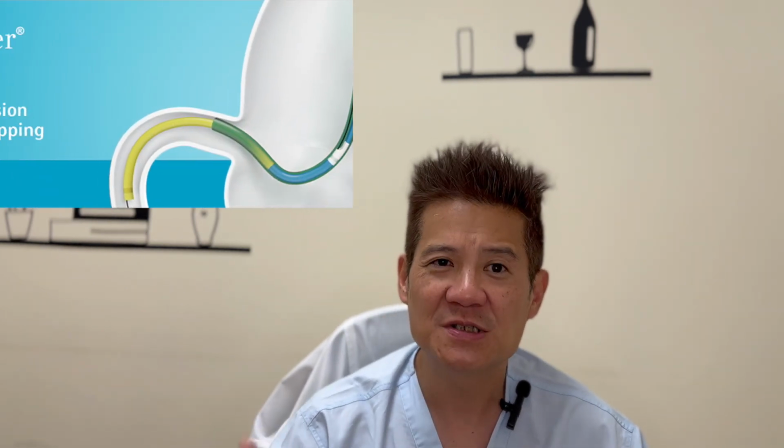In fact, the more stuff you have in your guiding, the more chance you introduce air and you introduce thrombus in your guiding. So the solution is to back bleed often, okay? But of course, this is easier said than done. The place that really is a problem for us, I think, is when we are using the trapping balloon. Because every time you use a trapping balloon, quite a lot of air gets introduced, and if you inject that air, bad things happen. So whenever we use a trapping balloon, we must remember to back bleed afterwards.